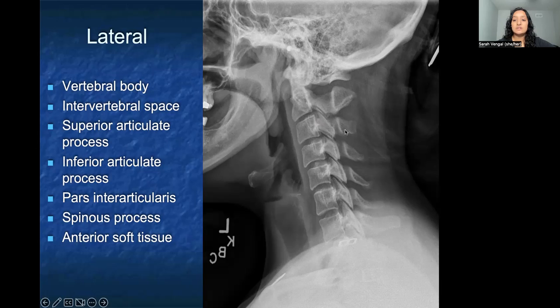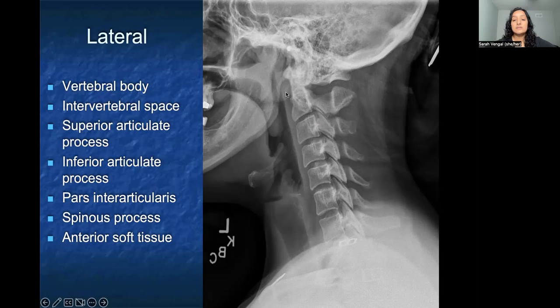Most posteriorly, you can see the spinous processes throughout. When assessing alignment of the cervical spine, I look at the anterior line of the vertebral bodies, the midline, and then the posterior line of the spinous processes to ensure the patient is well aligned. It's also helpful to look at the soft tissues anteriorly — swelling of those pre-vertebral soft tissues can be a sign of infection like discitis or osteomyelitis.